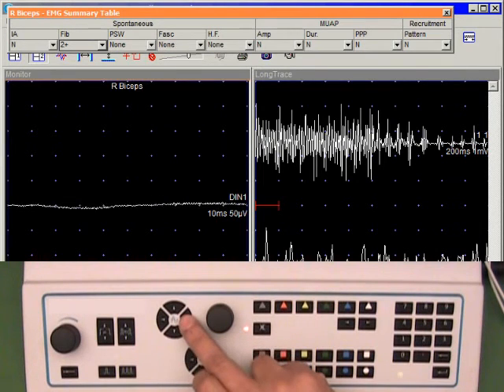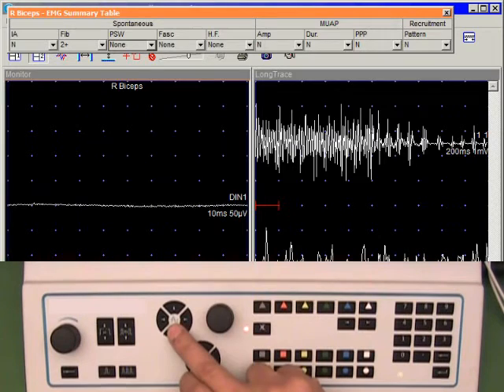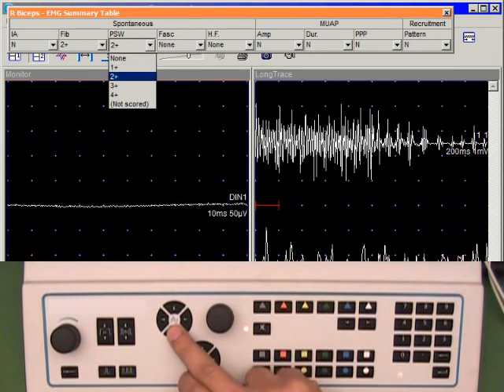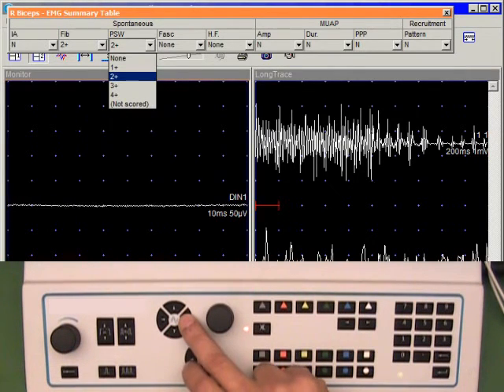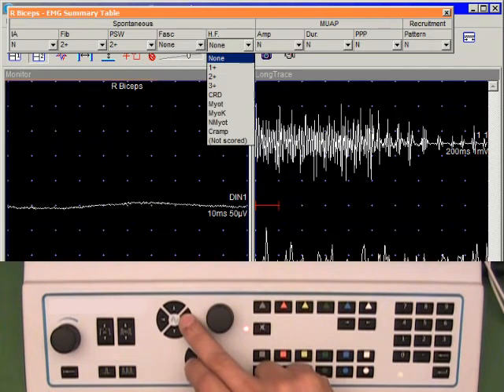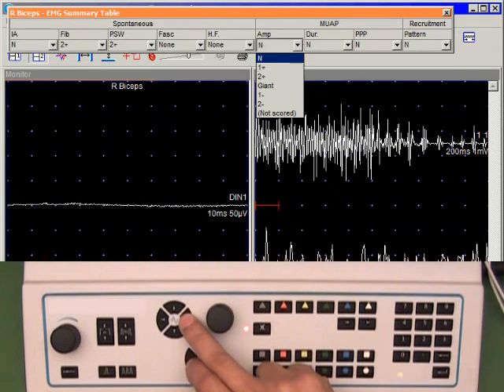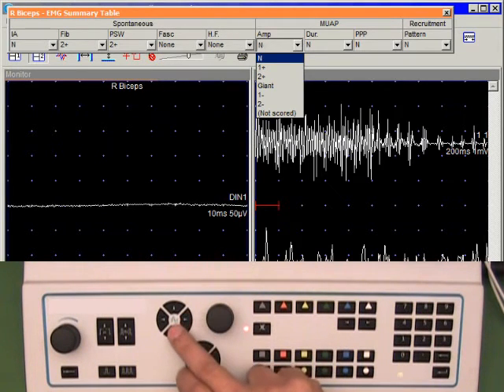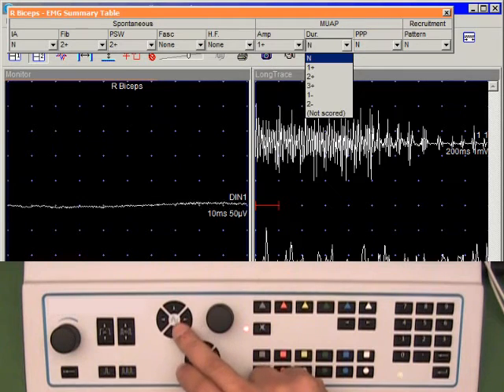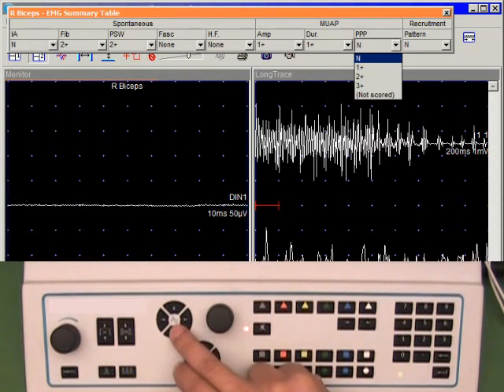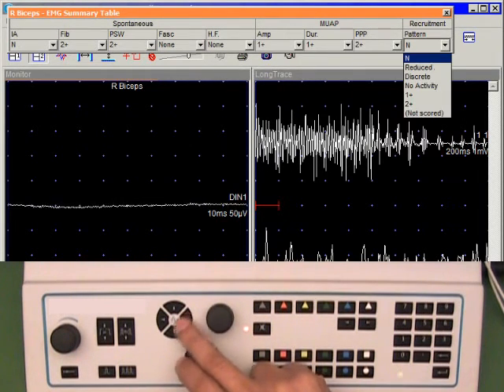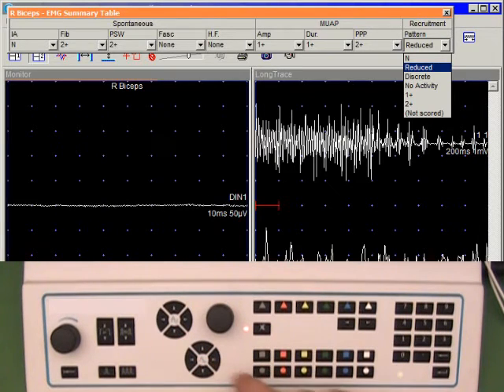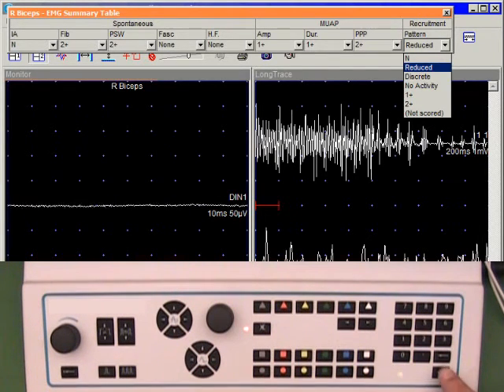I will use the right arrow keys to select positive sharp waves. Down arrow keys to highlight positive sharp waves. Nothing for fasciculations. High frequency discharges. Let's say mildly increased amplitude, duration moderately increased, polyphasic potentials and reduced pattern. To complete this entry press the enter key.